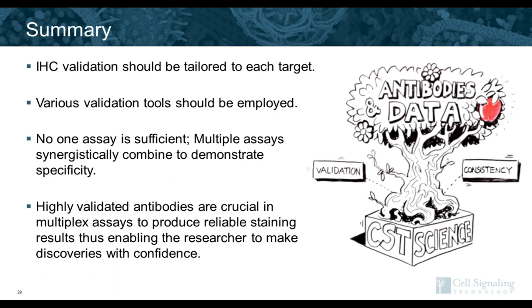As we mentioned, the particular variant he used is conjugated to biotin, which helps us avoid any mouse-on-mouse cross-reactivity. We don't currently have a rabbit monoclonal that detects pan-cytokeratin in FFPE tissues at this time.